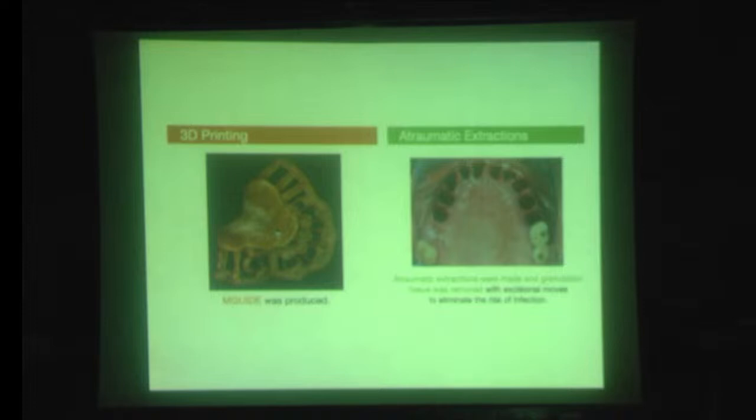Maybe you're going to do it for maybe 15 minutes, okay? Let's see the real redness of the blood, okay? It is a little bit different. So if you leave granulation tissue, it doesn't matter if you place the implant with Tesla, with M-Guide, with IOS, okay? Doesn't matter. Biology wins, and if we leave granulation tissue in the inner parts of the extraction socket, we will fail. So don't pass to the next step before cleaning the inner parts.